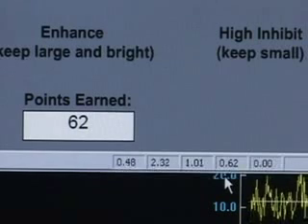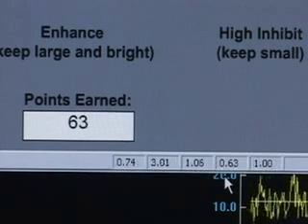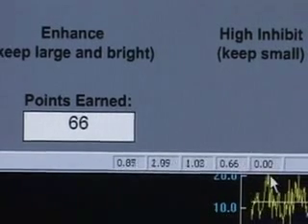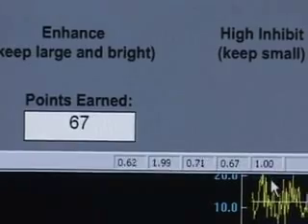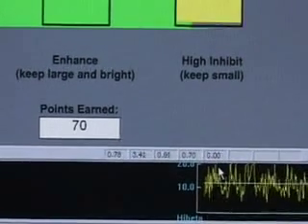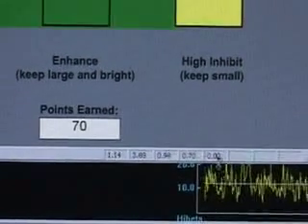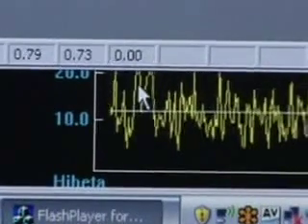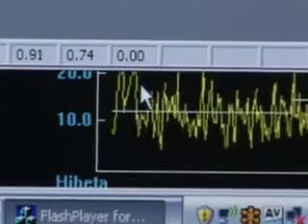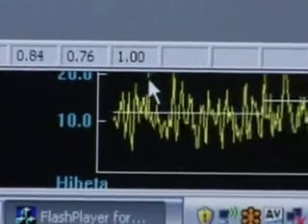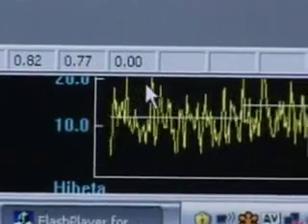These are the variables which are used by the bars screen. In addition, to the right of them, our fifth variable — we see it changing between zero and one. You may also notice that it becomes one just before the tones occur. One means that all conditions are being met. When this value becomes one and stays one for a half a second, that's when the tones appear.